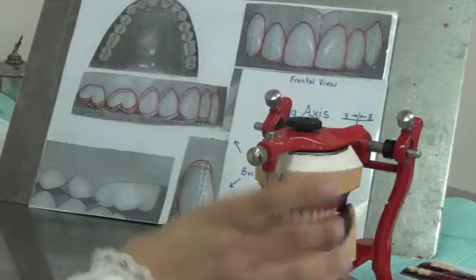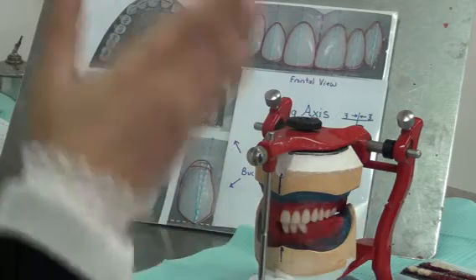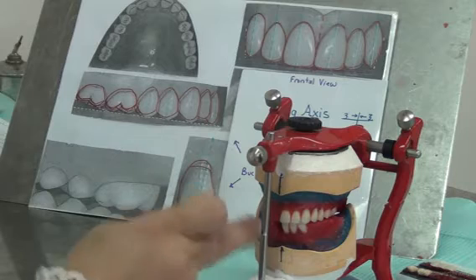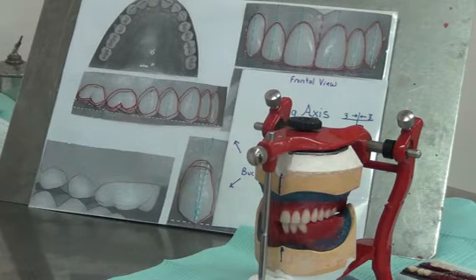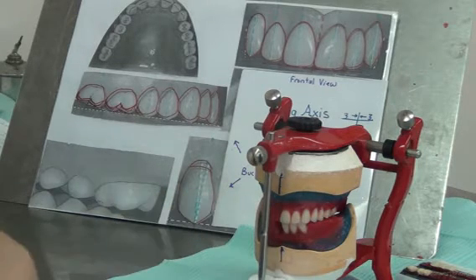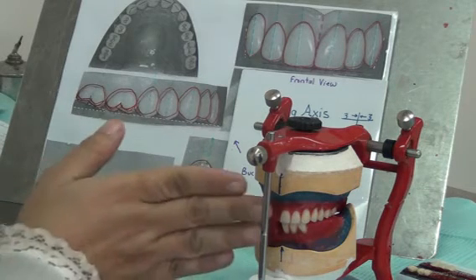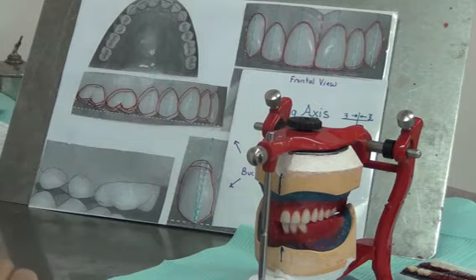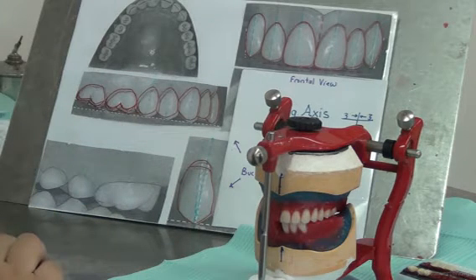This is how we mounted the casts in the beginning, and they should be coinciding with the midline of the pin and the midline of the jig in the beginning where we mounted. So all of these lines coincide, but sometimes looking far away from the incisal pin to the teeth will cause some confusion, so it's better to put something closer to the teeth and compare it. So we are checking that the midlines are correct.